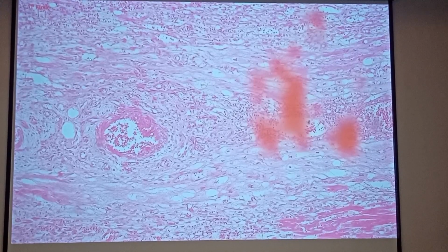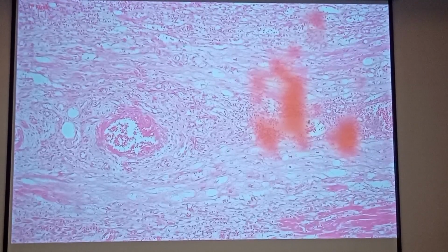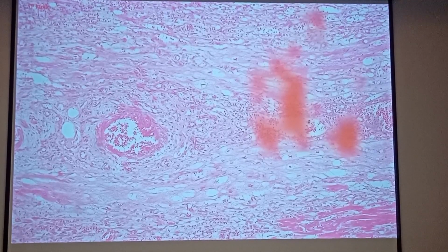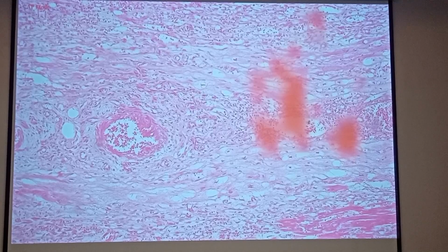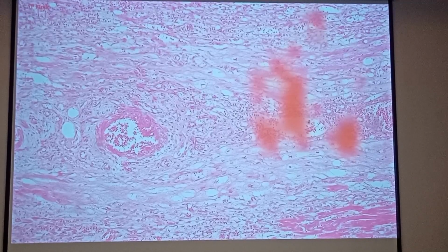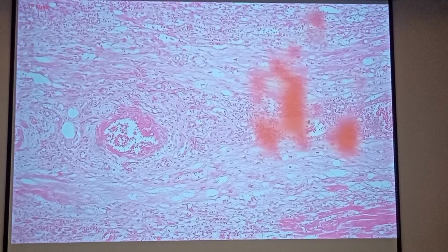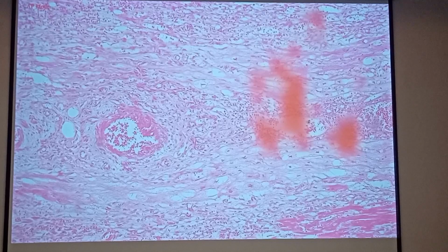Okay. So these pockets of things here, pockets of fluid. So I think there's still edema going on in here. And the hemorrhage that goes through this is actually a product of the newly formed blood vessels, which appear to be leaky. When you say leaky, things leak out of its contents, of its lumen. And even cellular contents leak out, including red blood cells. That's what accounts for the hemorrhagic thing going on.